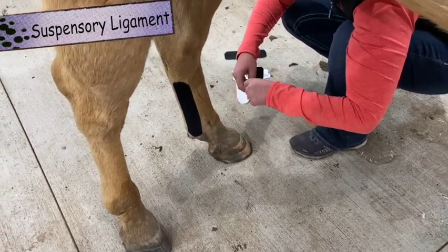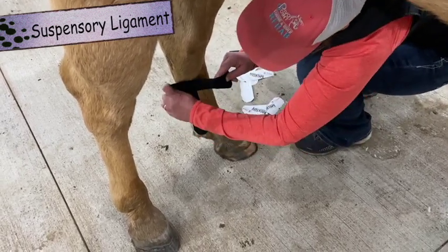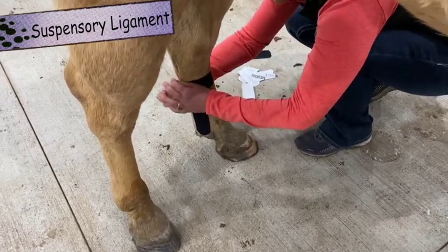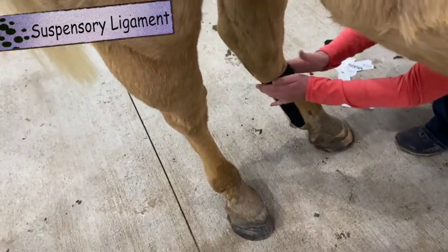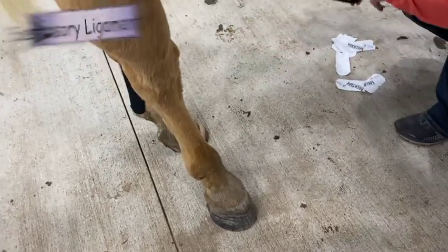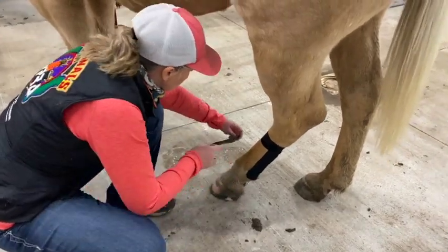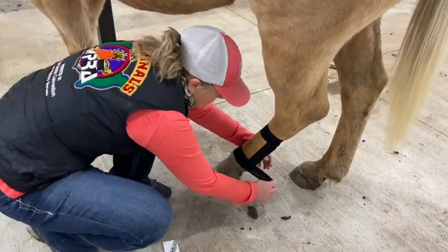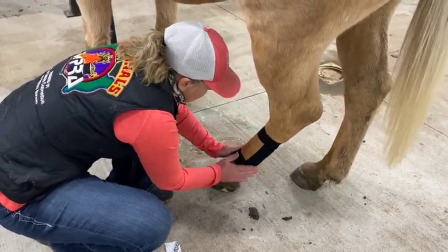Then we do the anchor pieces, which help everything stay in place. On this one we can put a little stretch on it, and it's going to go around his fetlock. His fetlock is a little bigger, so we go around it, placing it over the ends of the tape to anchor them. Then we anchor it back on itself and rub it.